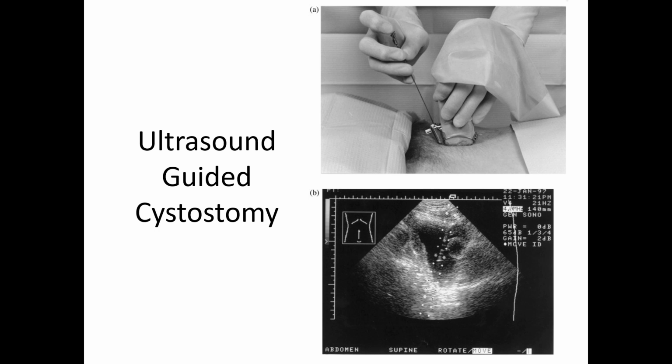And this is the ultrasound-guided cystostomy. In A, the ultrasound, and there is this area, the suprapubic. The patient has been well prepared and draped well, and after cleaning all these areas by aseptic technique, the urologist or radiologist is going to start to puncture the bladder, and then you push your needle inside.